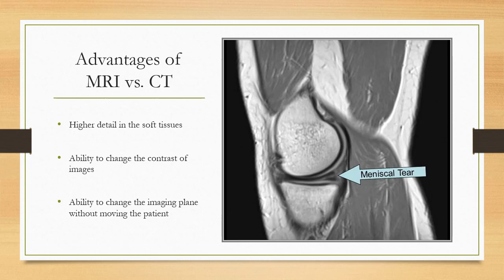You can also change the contrast of the images to view the soft tissues better. And the evaluator has the ability to change the imaging plane without moving the patient.